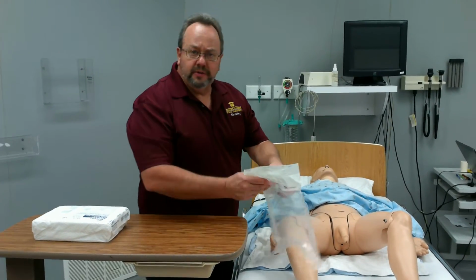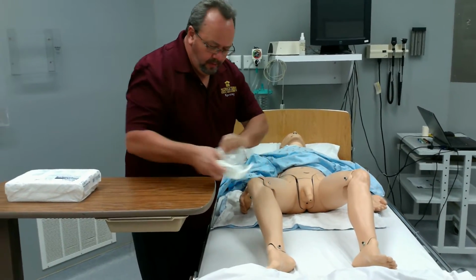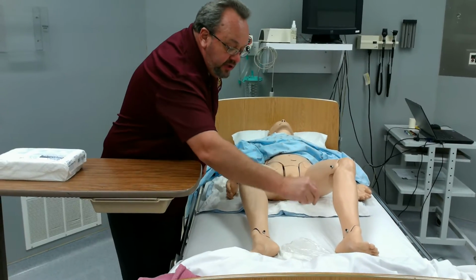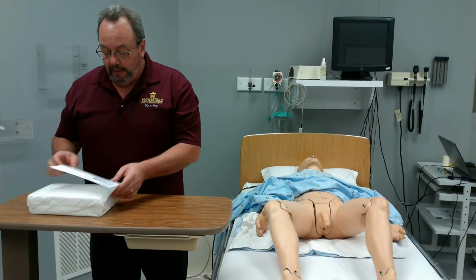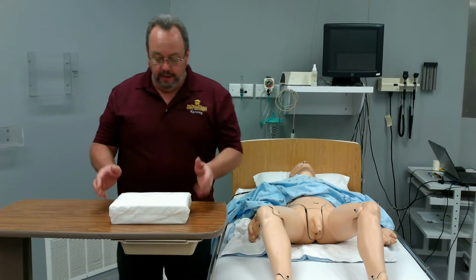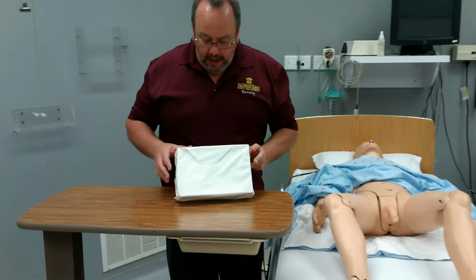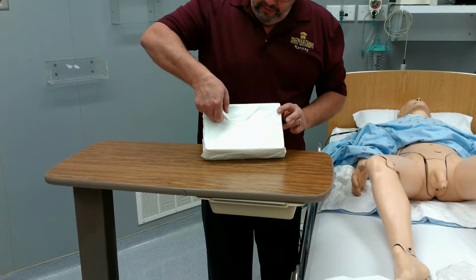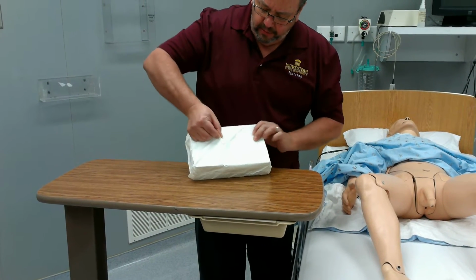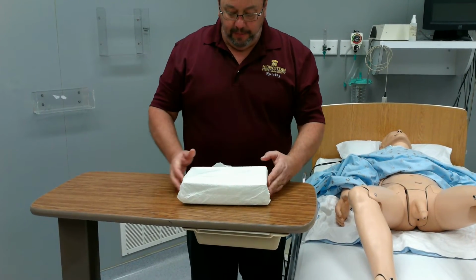This I'm going to use as a trash bag. So I'm going to roll this and make a good flat trash bag I can just drop my cotton balls into. I won't need this. I can throw this away into a trash can, and then I'm ready to open my kit. On the back of this, there is a piece of tape right here, and it's holding this flap down. Do not try to peel that tape off because you may end up ripping your sterile field. Just rip that corner off and let it open.